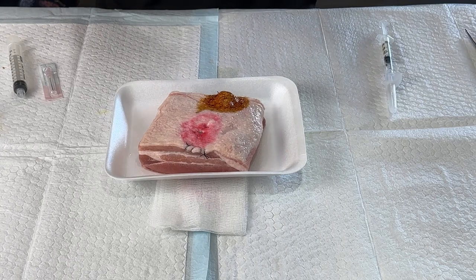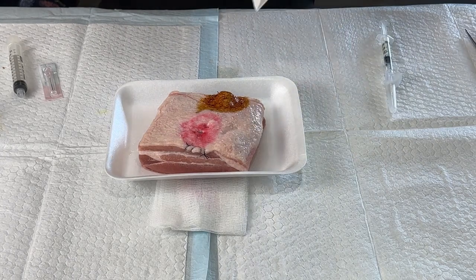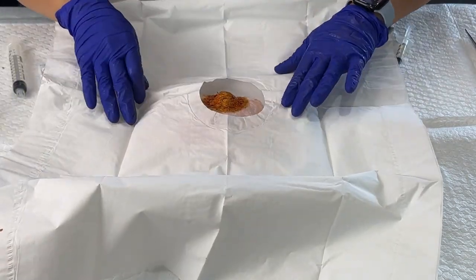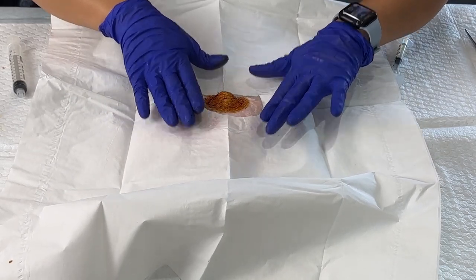Then we would grab our fenestrated drape. I'm going to show you my fenestrated drape here and just cover up everything that is not what I want to work on. Now my hands would be sterile in this area, and that's what I would want to see.